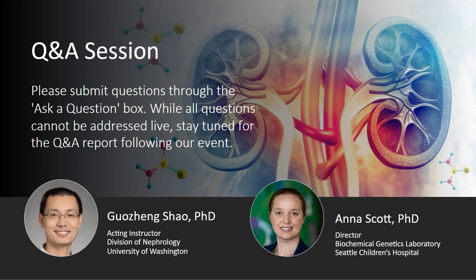Actually, I was wondering if you might be referring to other chemicals we can see on the HPLC analyzer. And so I want to just touch on this briefly. We can see a variety of medications, mostly antibiotics.